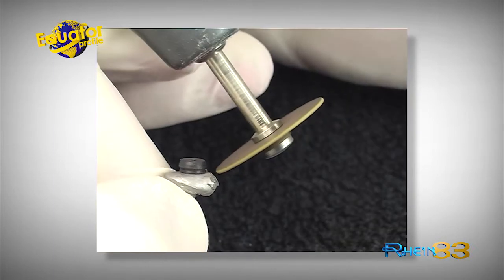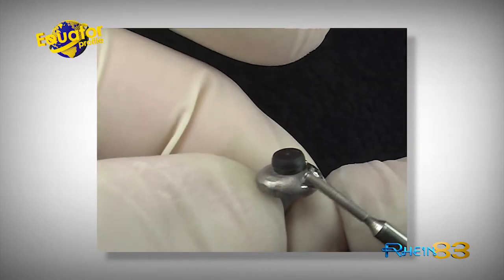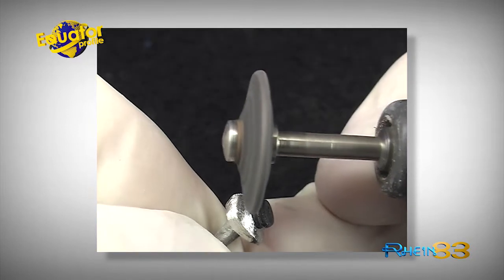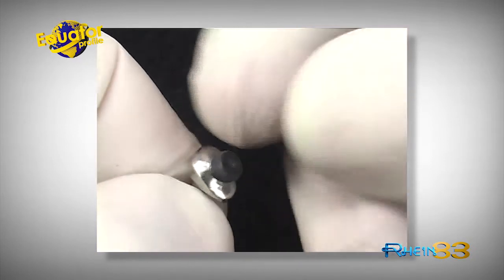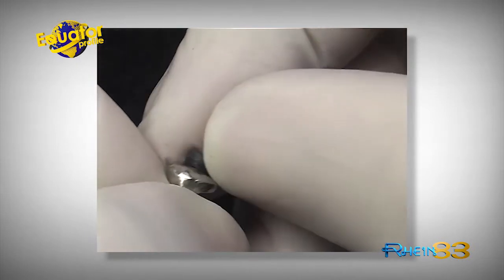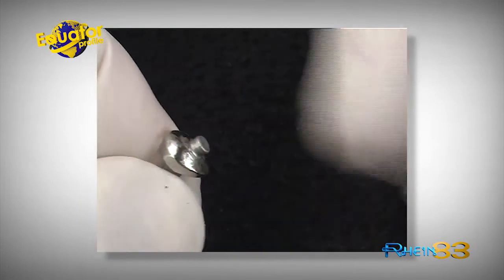Be very careful when polishing and refining the attachment. Thanks to the black cap, the attachment is protected from over-polishing or damage. Do not polish the retentive area of the attachment.